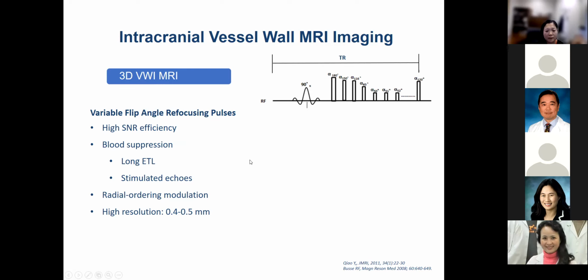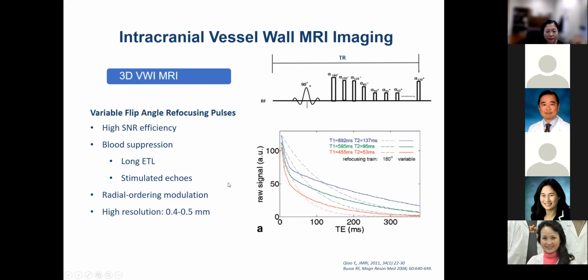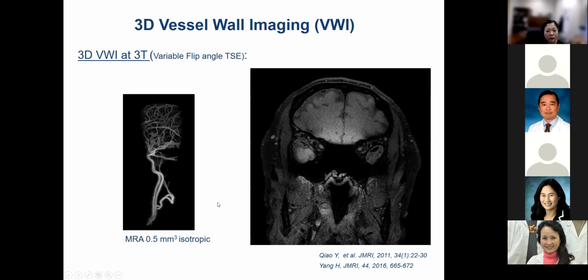This technique is quite efficient, so we can acquire the whole brain with high resolution, around 0.5 millimeter, and has strong blood suppression, within around 7 minutes. So this is just showing the image.